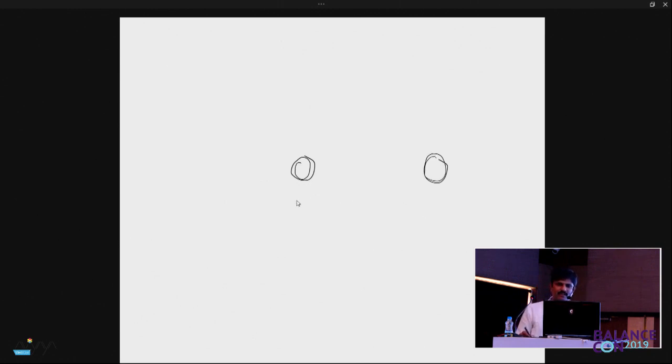Now start from here and go here and stop in one jerk. Now let us imagine this eye has a problem. Say this particular person has a problem in measuring distances and underestimates the amount of distance that needs to be covered. What is that called in cerebellar sign? Underestimating the distance? Hypometria.